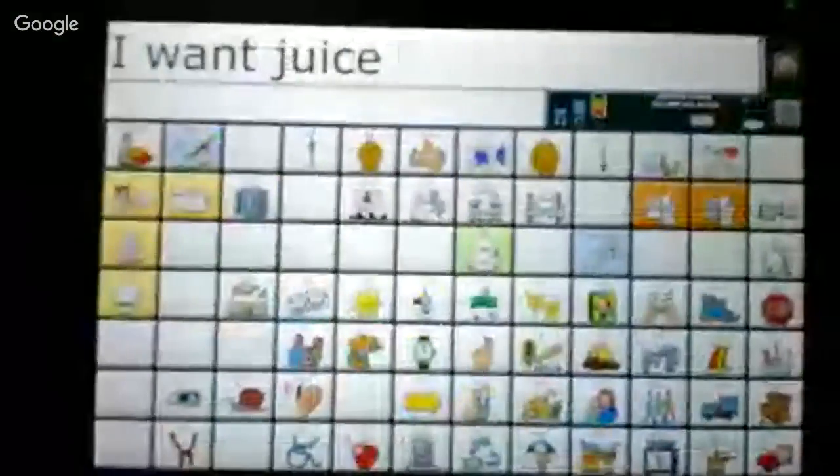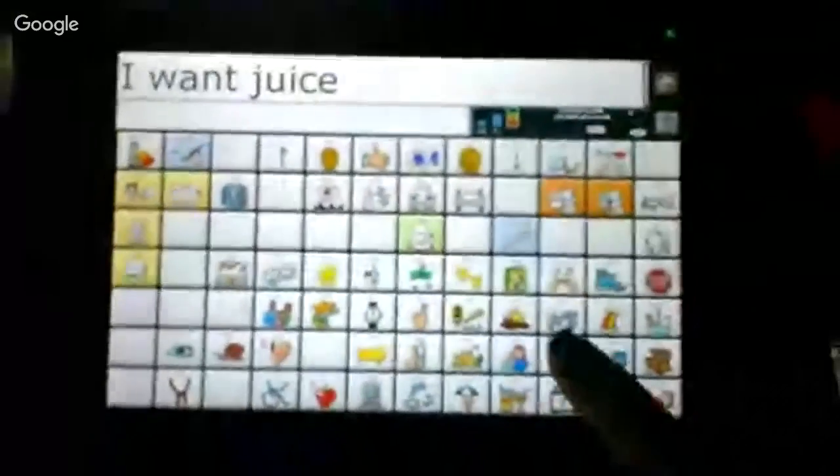And then the other kind of difficulty I've come across with it is that when you have behavior technicians working with the client and they're trying to prompt the child how to ask for something, they need to know where the word is stored. And some of the pictures on the front can be a little tricky to figure out. So like you click on this elephant and under it is the word big. So you might not think to look there for that word.